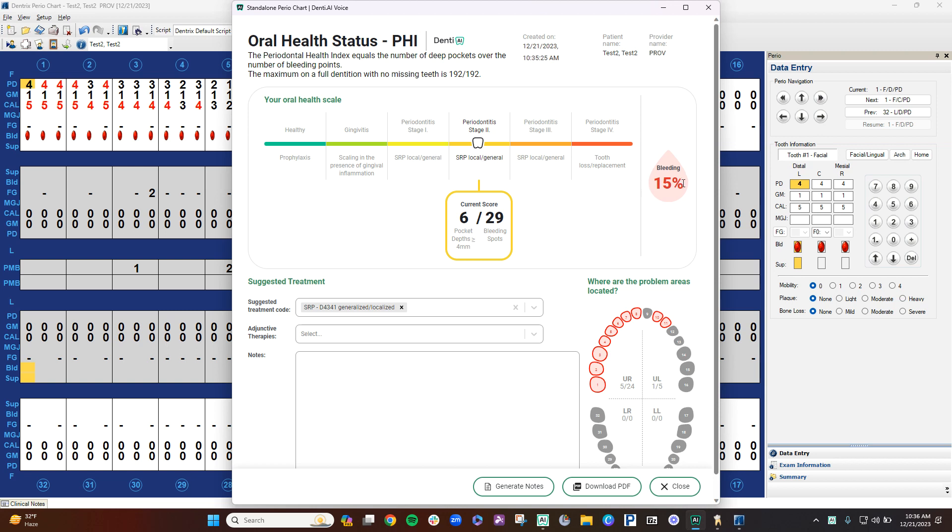Again, with the bleeding percentage, it auto-generates that as well. So if you get to 30%, you can look at the images, make sure there's no bone loss, then you're able to use the D4346 code, which is the gingivitis code.